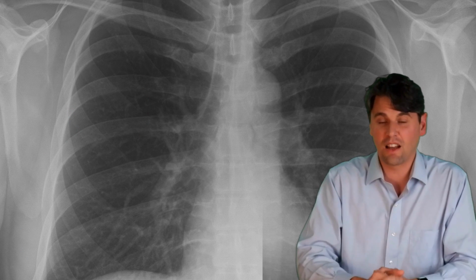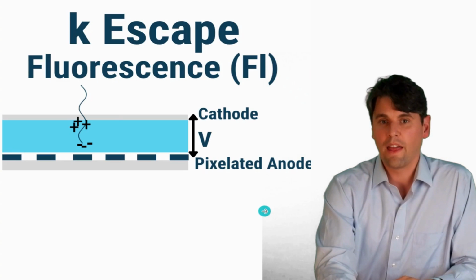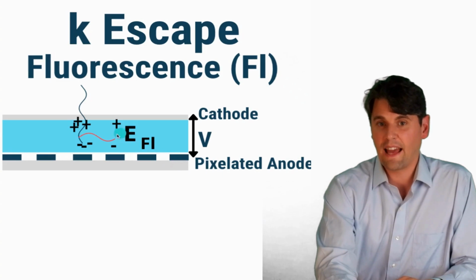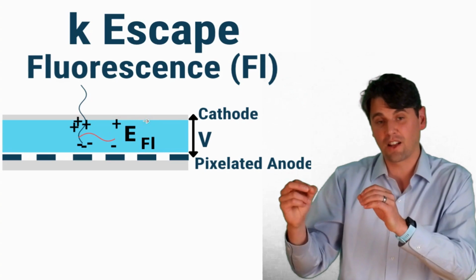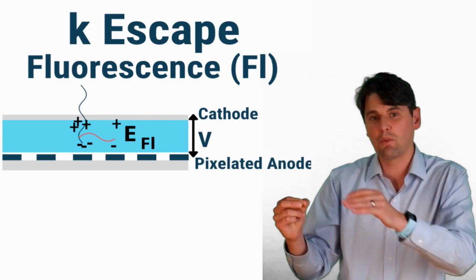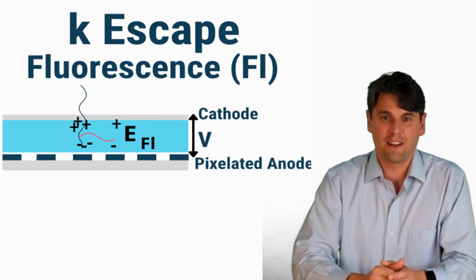And in order to preserve energy, it's actually going to emit what's called a fluorescent photon. So in that scenario, that can actually happen inside the detector material.